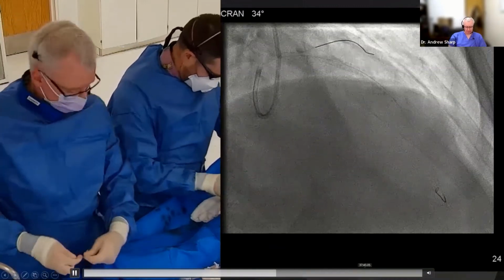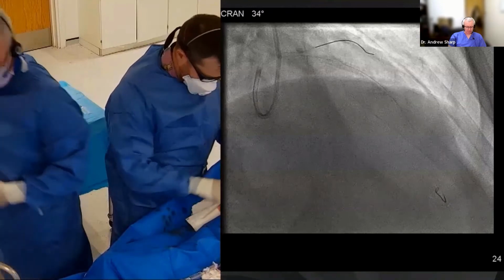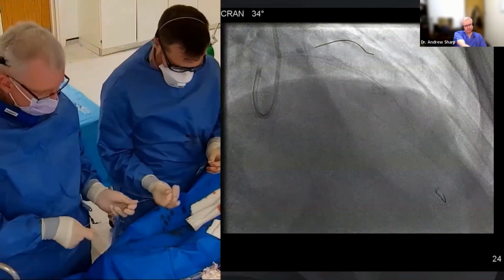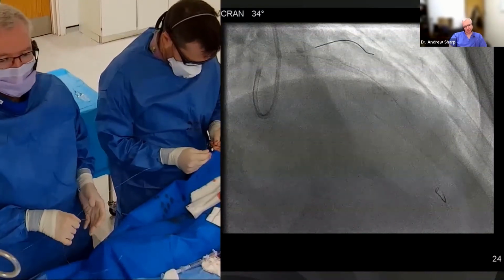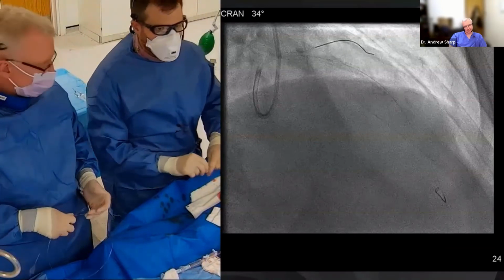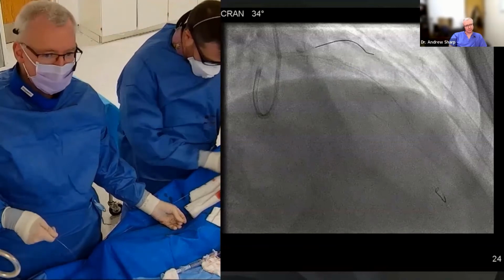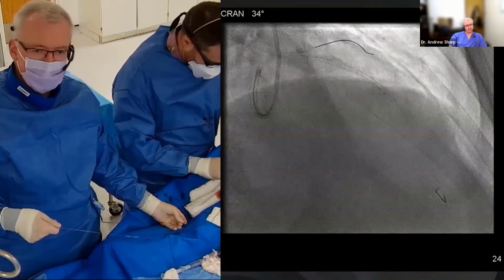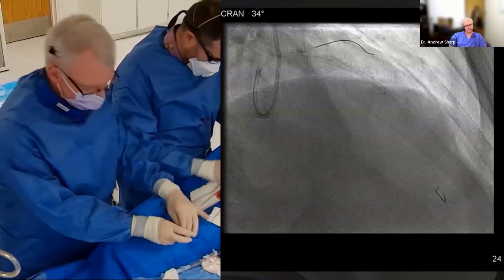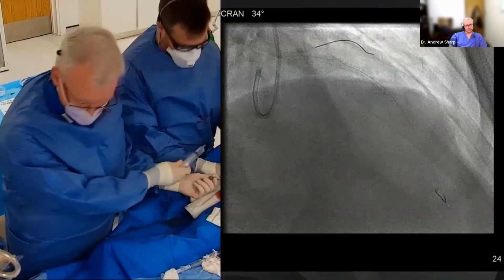Okay, so what's your next balloon? 3.5? 3.5. Yep. We're just distal to the bifurcation. And there's your wire. That's to be said, I would have thought it would have been longer than a 38, just looking at the angiogram. Yeah, no, I agree. I said 48 just because my brain was looking at the angiogram and thinking it looks longer, but, well, it's not, is it? No, it's fascinating. Have you got the prep syringe there? There you go. I'll give that to you and I'll do it.